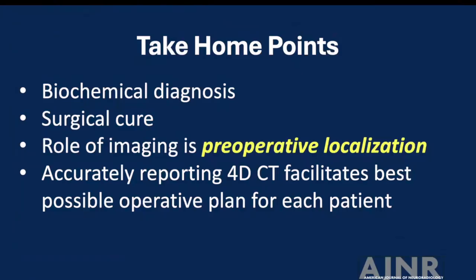Okay, so what are the take-home points? Well, I think it's critical that you understand that primary hyperparathyroidism is diagnosed biochemically and cured surgically. The role of imaging is preoperative localization, and it is my belief that by accurately reporting what the surgeons need to know from parathyroid CT, we as radiologists facilitate the best possible operative plan for each patient.